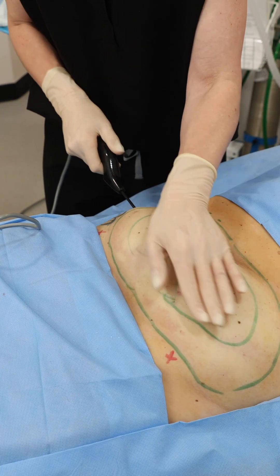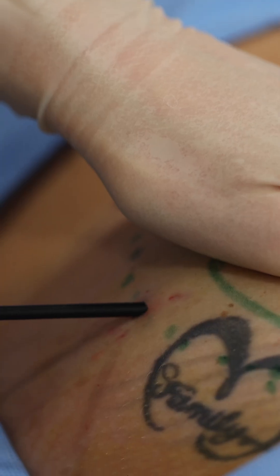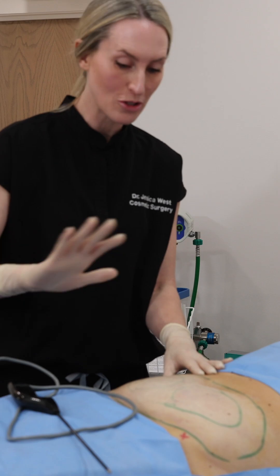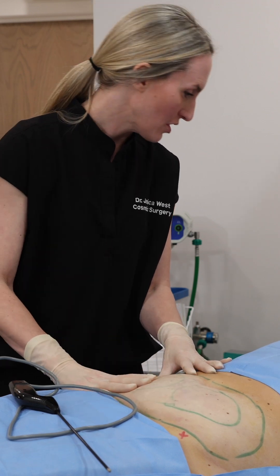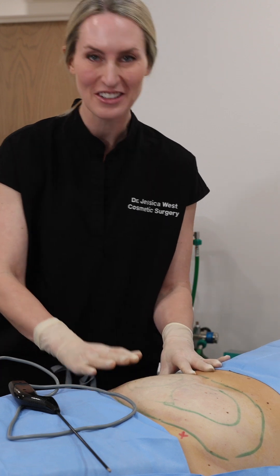It's so satisfying to hear the crackle. We just completed the procedure. It's normal to be numb for a couple of hours, and then we'll just close up your small little incision and give you some light compression after this.